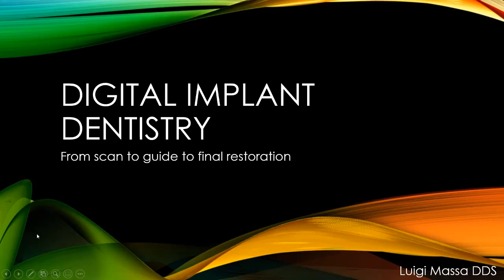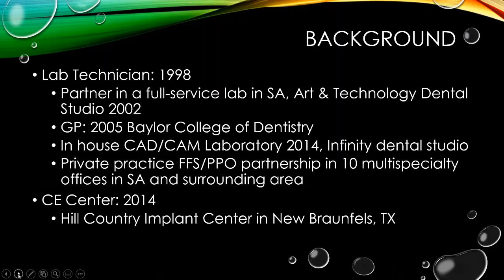Hello, everybody. Our program tonight is digital implant dentistry from scan to guide to final restoration. And we're going to walk through that process here tonight. We'll talk for about 45 minutes, and then at the end, we'll open it up for a question and answer. So if you think of anything as we go along, make sure and jot it down, and we'll try to address all of those questions.